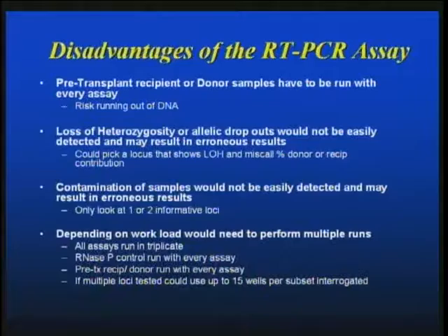Contamination, much as we would not like it to happen, does happen, even though it is fairly rare. With the STRs, it's very easily detectable simply because you're looking at so many different loci. With this, if you're only looking at 1 or 2 informative loci, there's no way you'd pick up a contaminant, especially if it happened to be of the same flavor as what you're working with.